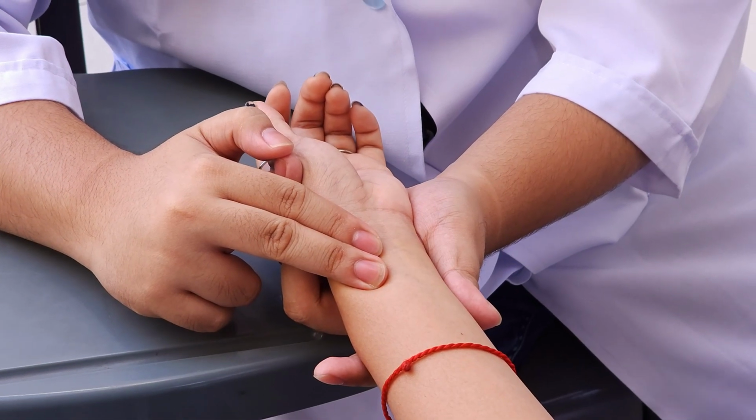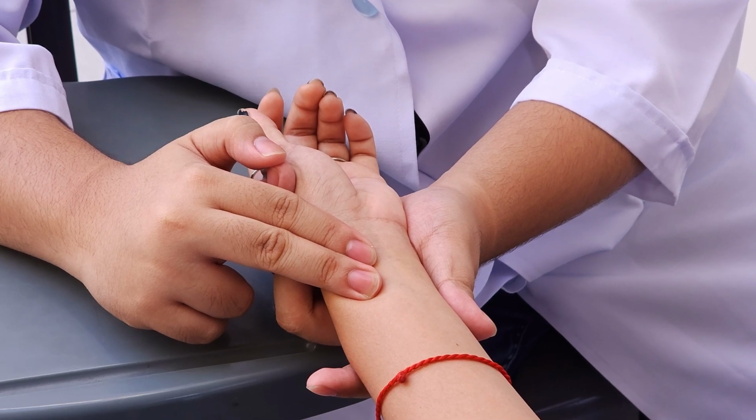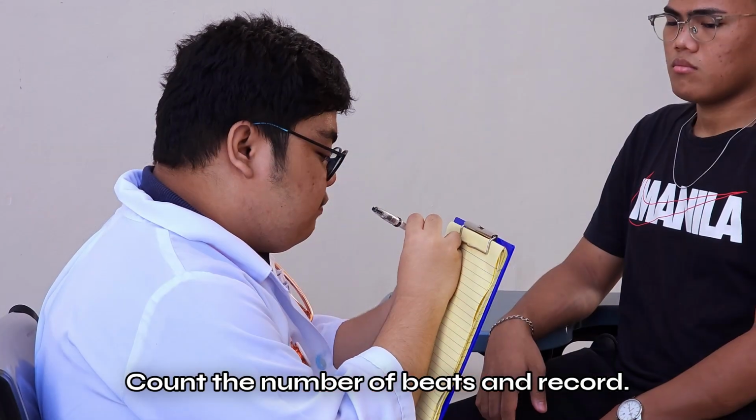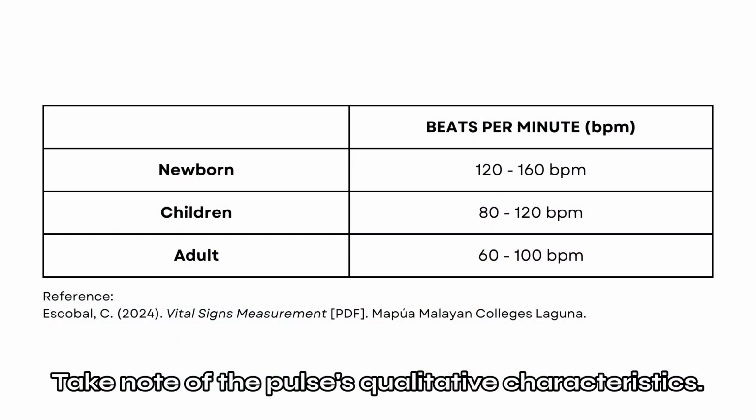For infants, take the pulse rate on the apical pulse. Count the number of beats in 1 full minute and record it. Take note of the pulse's qualitative characteristics as well.